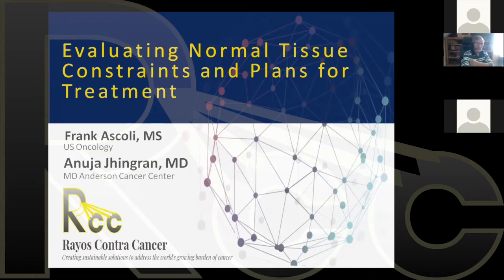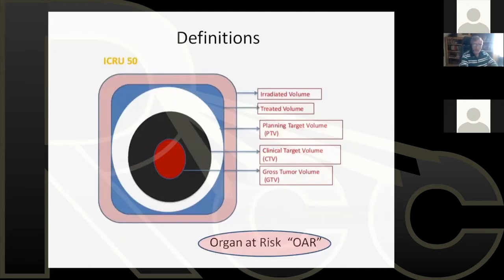This is a very, very important part of treatment planning and will help make clinical decisions that will affect the outcome of the treatment, to improve it, and also to minimize the side effects. My talk is going to be a little more physics oriented. I'm going to be talking about some of the definitions that we use in evaluating plans, and I'm going to be presenting several plans from my center and go over how we evaluate those plans.